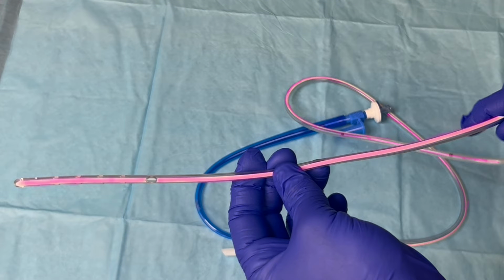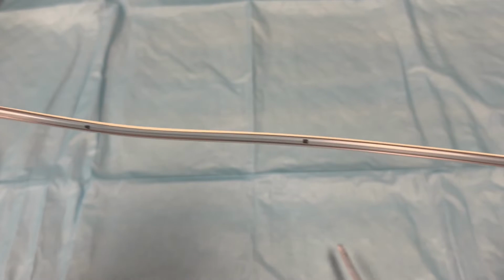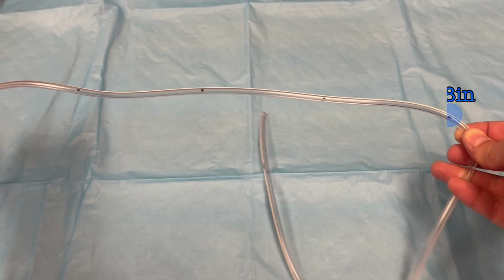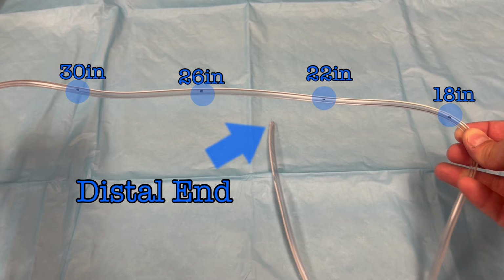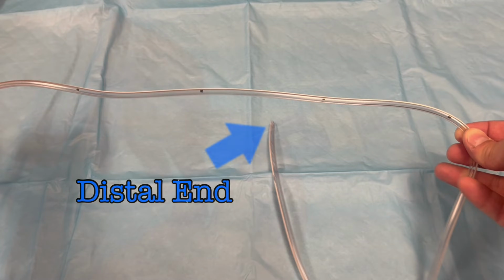There is a radiopaque strip embedded in the tube to allow for visualization of the device via X-ray. There are also markings indicating distance of the tube. The first black dot represents 18 inches, then 22 inches, then 26, and then 30 inches from the distal end of the tube. That's the end sitting in the stomach.